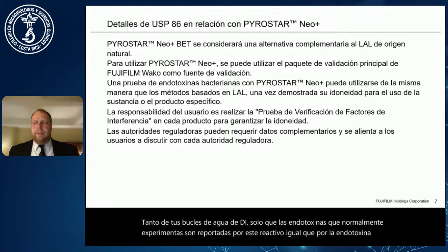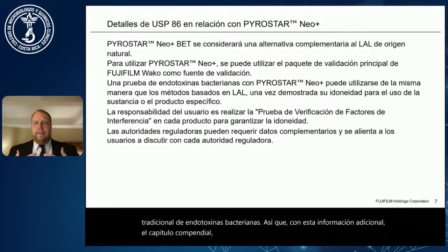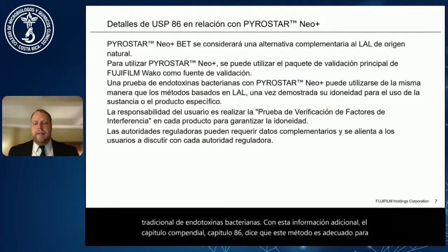So with these additional pieces of information, the compendial chapter, chapter 86, says that this method then is suitable for being substituted with USP chapter 85.